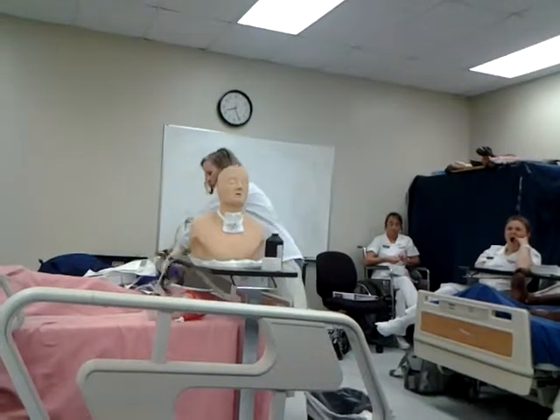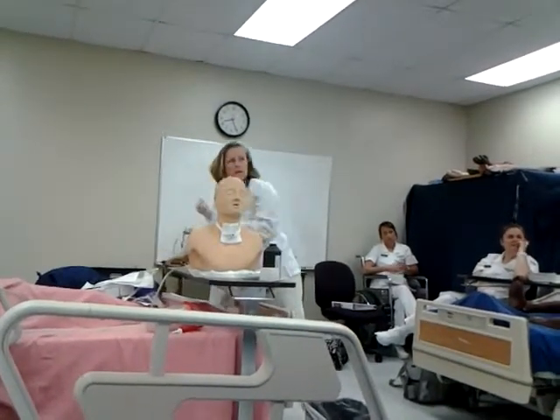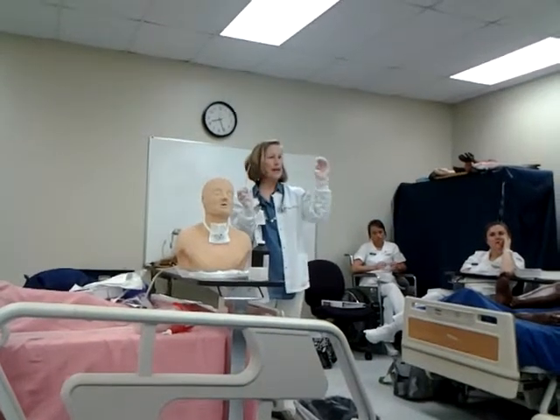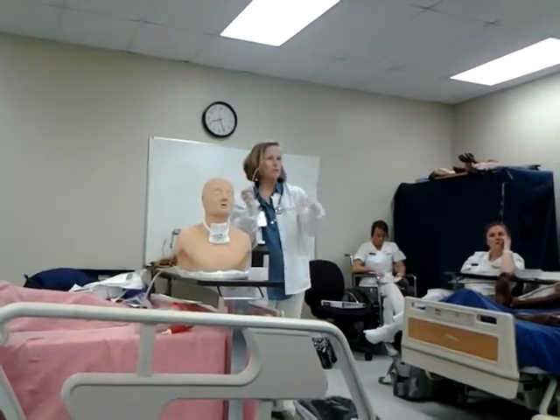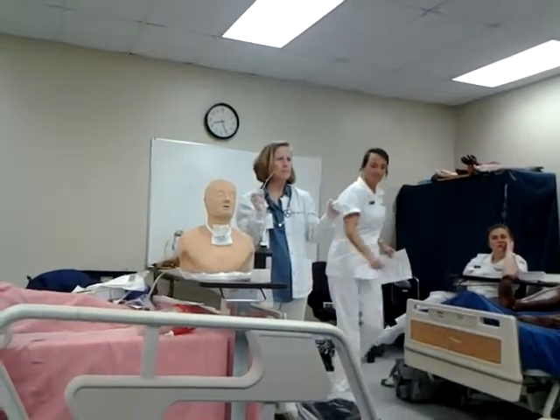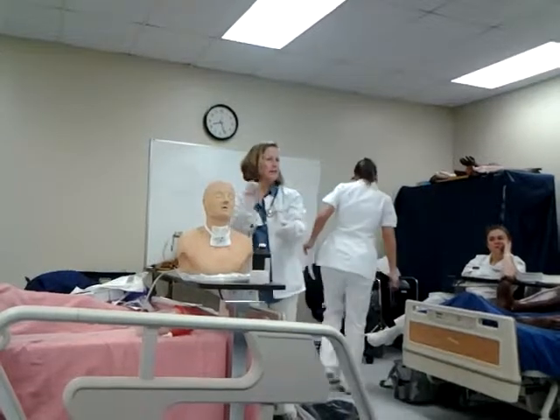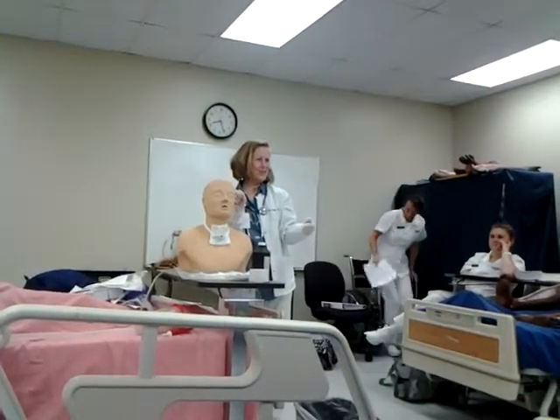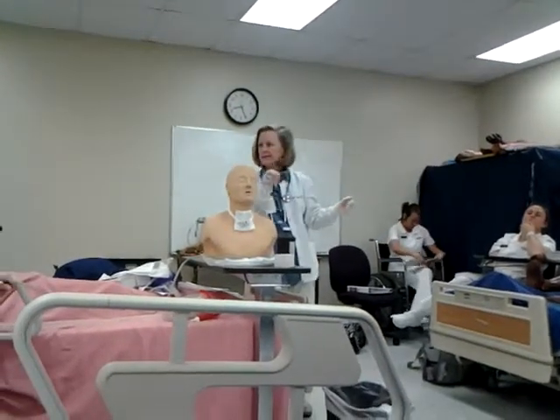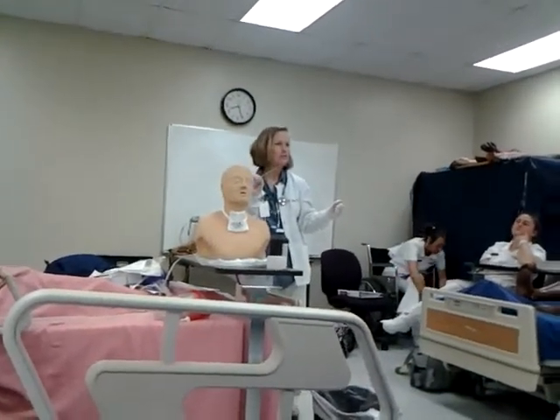So when you go down, you've got the curved end going up? It doesn't really matter because you've got that cannula and it's going to go in the way it wants. Oh, okay. It's going to follow that inner tube. Okay? And if I had this patient, and I'm kind of standing to the side so that you can see, if I were really in front of the patient or at the bedside, it would be much easier.